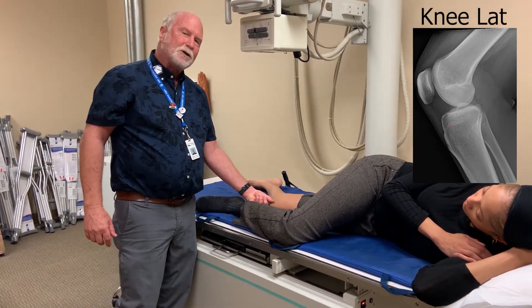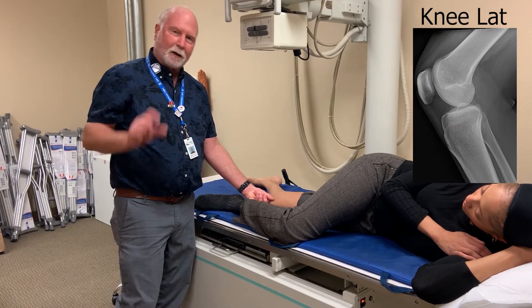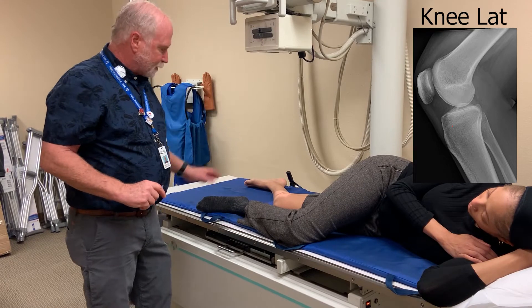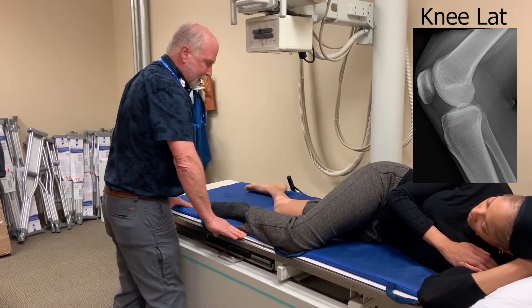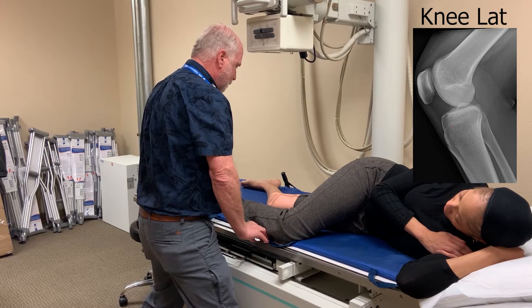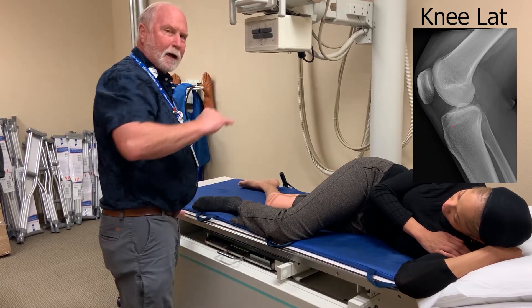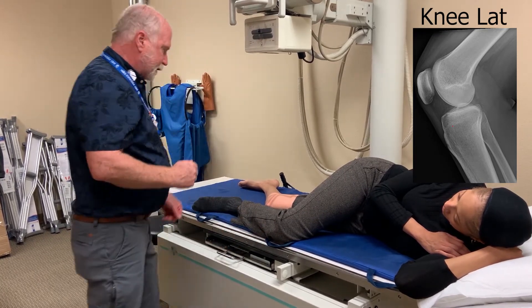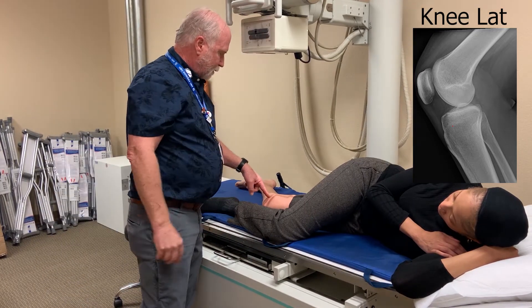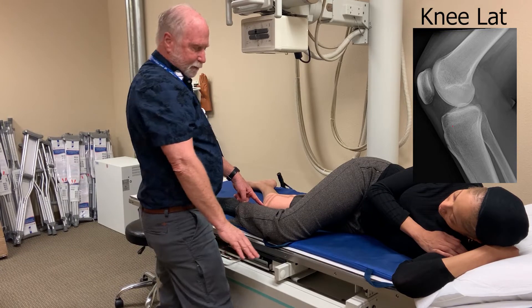I'm going to look at her patella. You can't always trust the patella because a lot of times it's a little bit misaligned laterally. In her case, it looks like the patella is pretty much a straight line. I'm going to get a straight angle on Nikki. If somebody had a really large hip, I might angle up; real small hip, I might angle down. It looks like she's pretty even. Again, I'm going to center just below the patella as far as joint space.